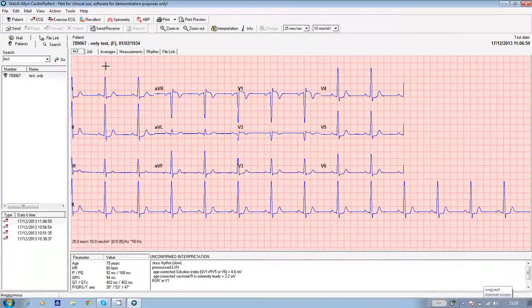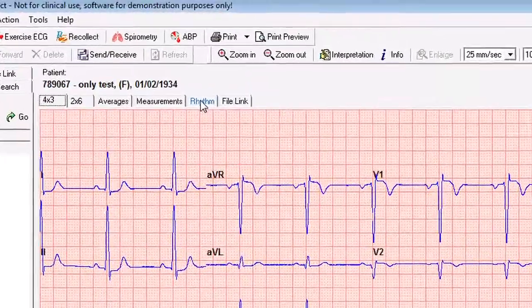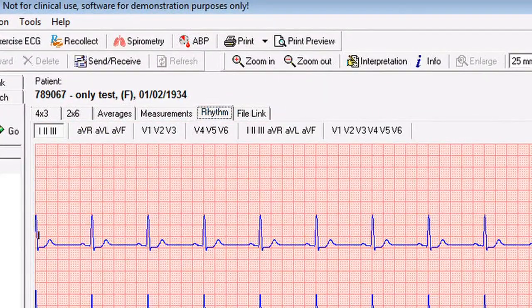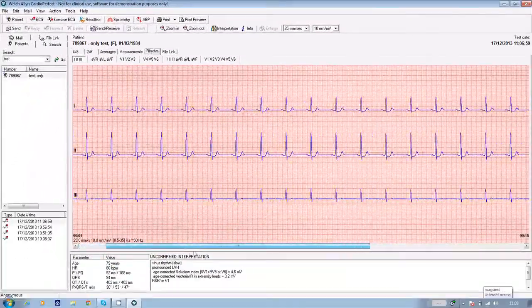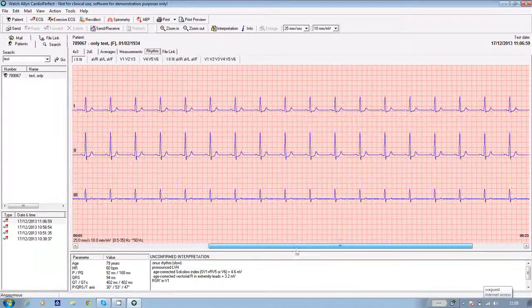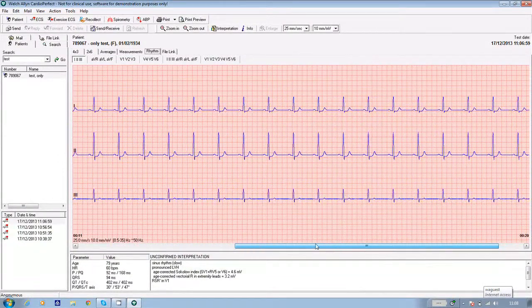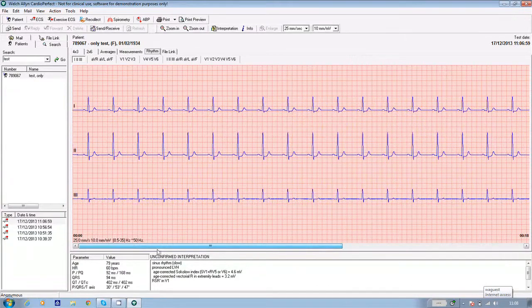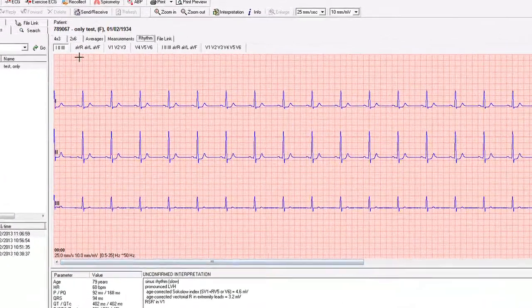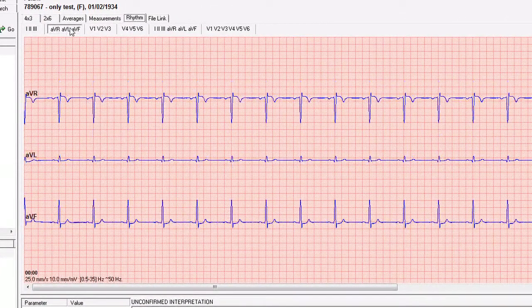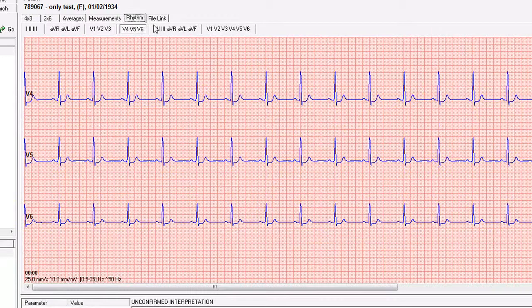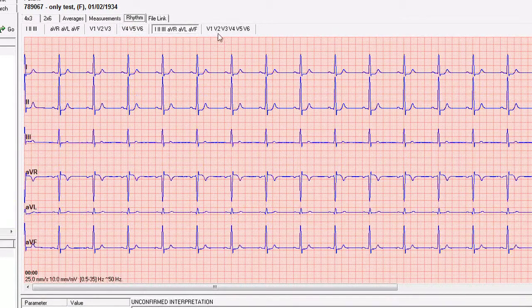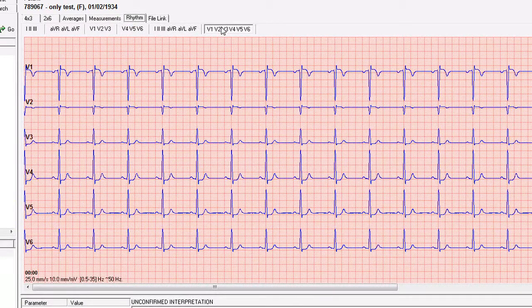Now to look at rhythm ECGs, go back into your software, open your test in the same way, click on the rhythm tab above the ECG and use the slider bar to take you through the whole test. You can do this in four groups of three leads or two groups of six.